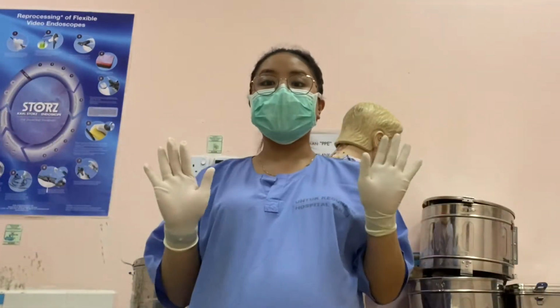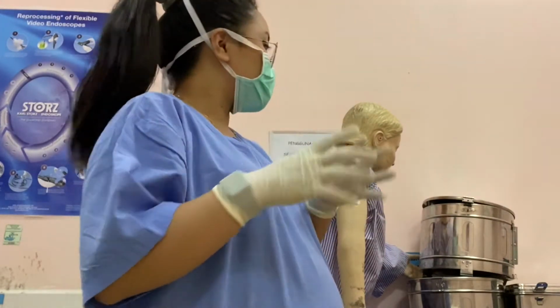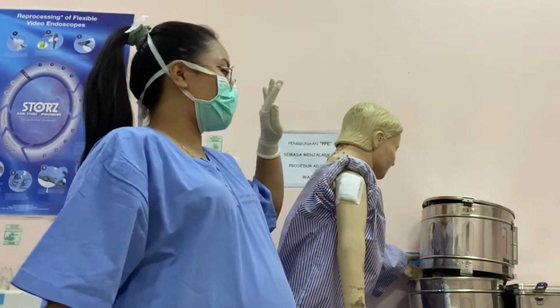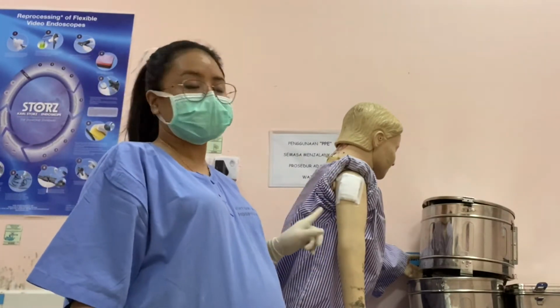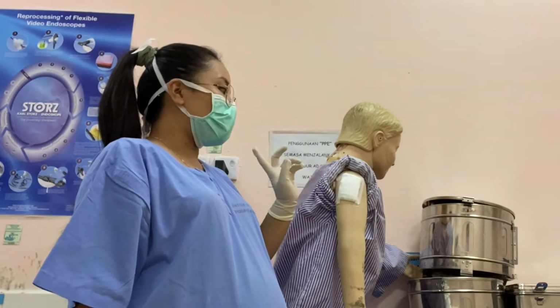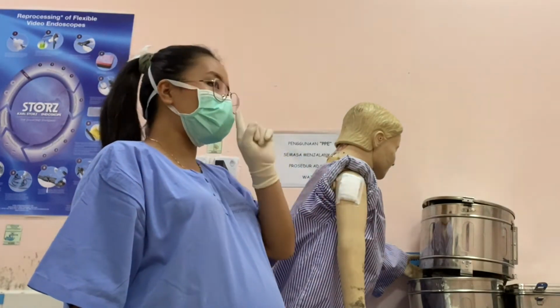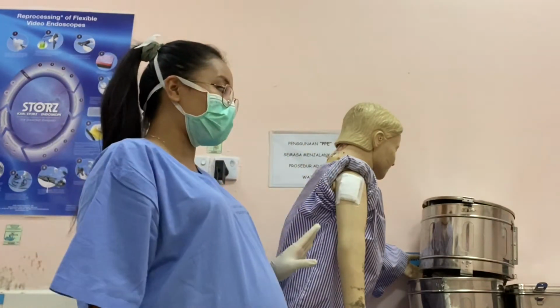So now I'm already wearing my PPE, which is the gloves. Firstly, this is the deltoid region, deltoid site. Basically, only 1 mL of medication injection is given to this area.